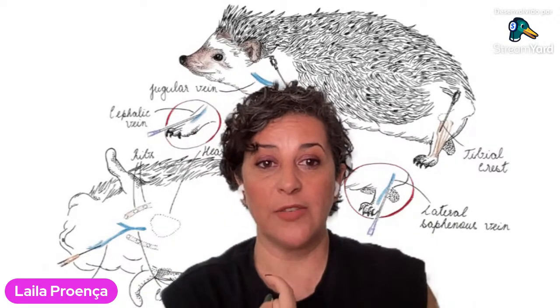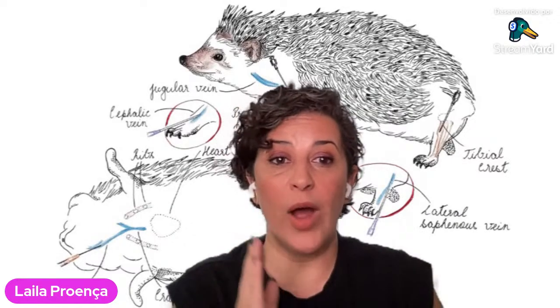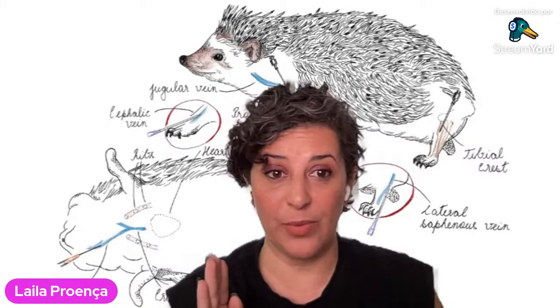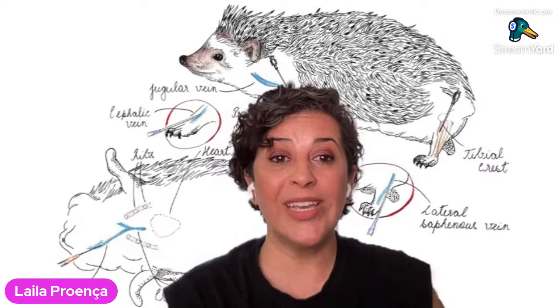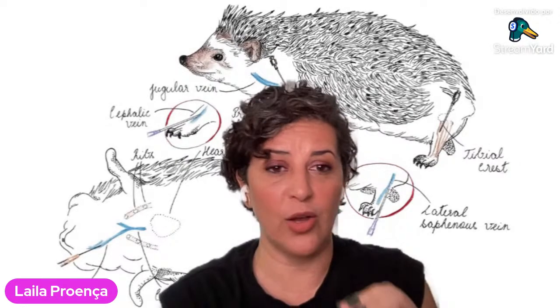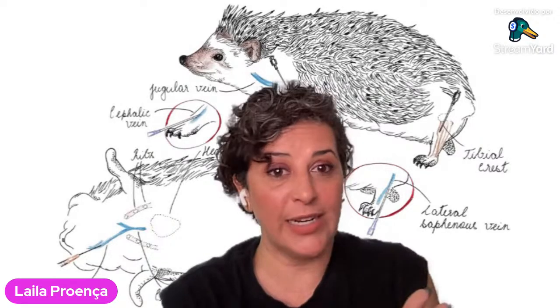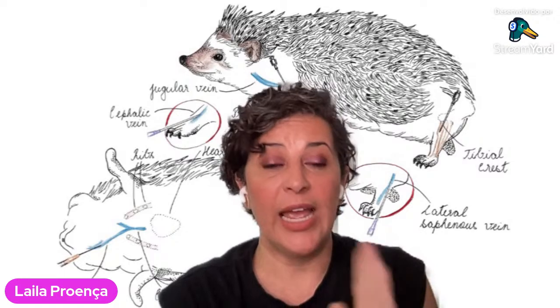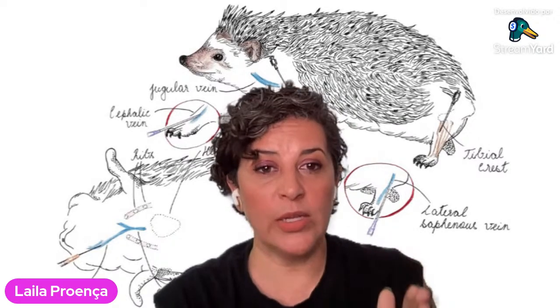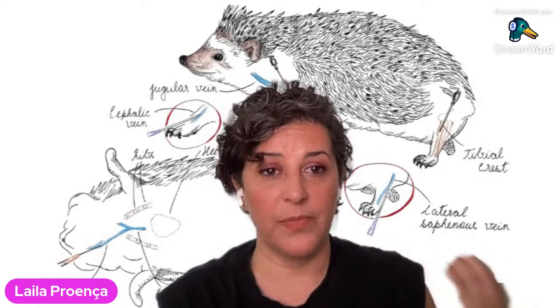As you can see here in the illustration, I'm not proposing you collect from the cranial vena cava. I'm proposing you collect from the jugular. And why is that? Their heart is very cranial. It's not caudal like the ferret, okay? You can definitely lacerate that. You can definitely do an intracardiac collection and lacerate and kill the hedgehog. How do I know that? I've done it, okay? And I don't want you to do the same thing. So the only safe place if you want to collect from a large vessel is the jugular, not the cranial vena cava.